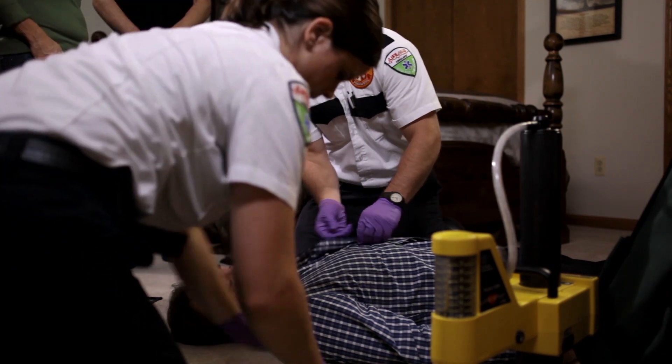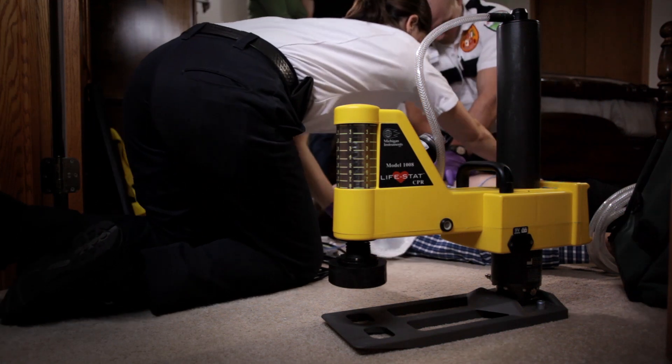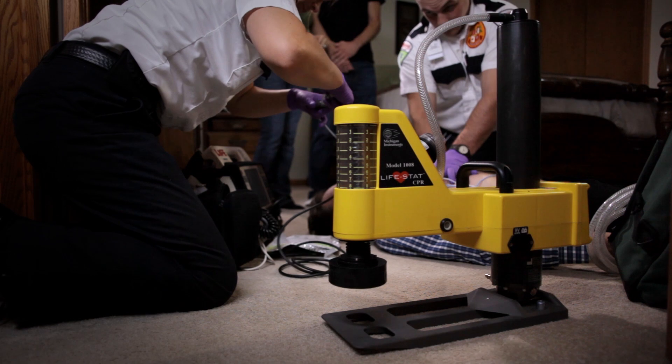The Lifestad Hands-Free CPR system provides cardiopulmonary resuscitation in accordance with current American Heart Association guidelines and can be updated should those guidelines change.